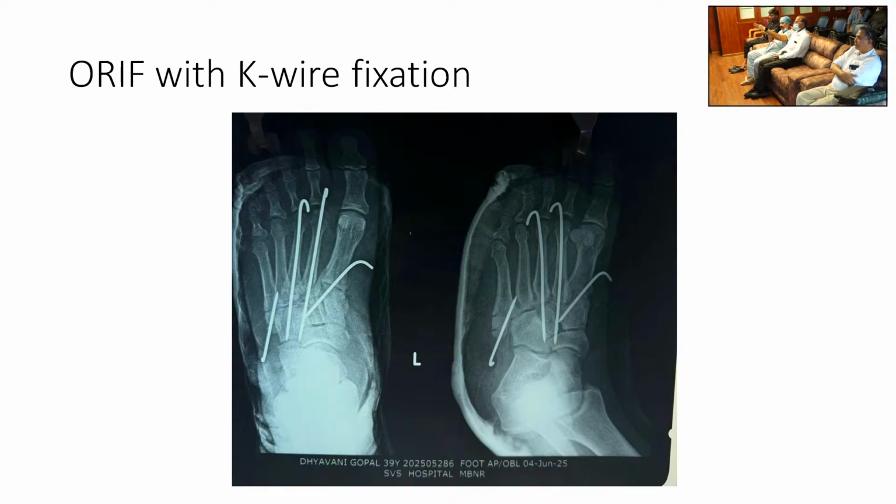Is the angle restored here? Intermetatarsal angle. Yes, sir. Right. Is it necessary to put K-wires into the second and third one also? If you push the lateral most fifth metatarsal into position, all the other will fall back into position, supposed to. Is it necessary to put K-wires? It was loose. Complete. It has gone outside, with the patient's come inside, right?